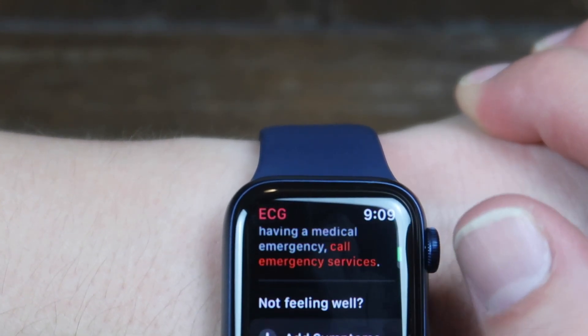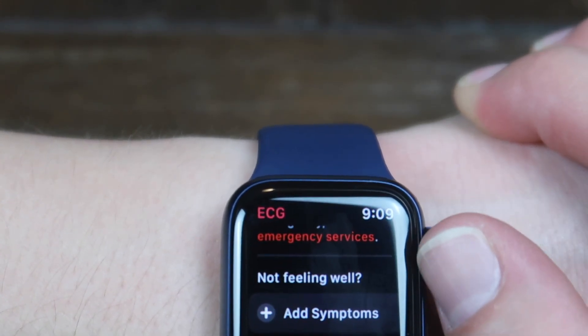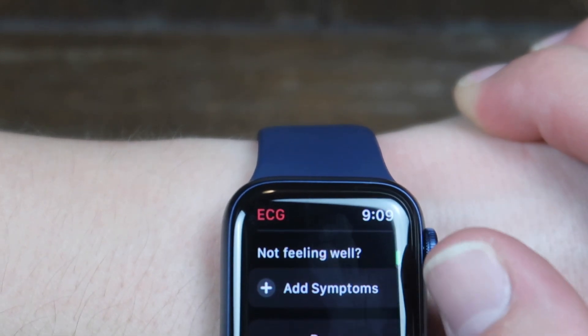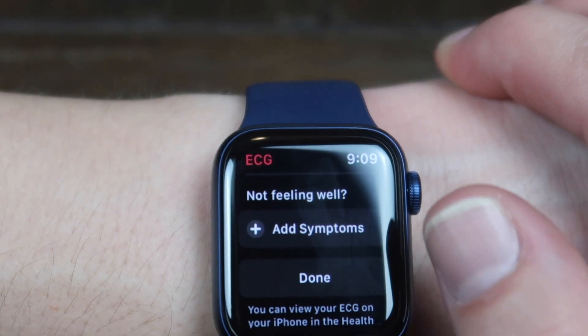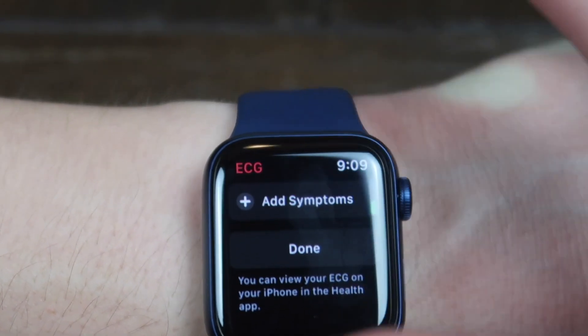It does not check for heart attacks. If you think you're dying of a heart attack, it says to call the emergency services. It also has the ability to add a symptom. So if you're not feeling well and for some reason you didn't get a reading you expected, you can add a symptom to track. I'm not going to do that.